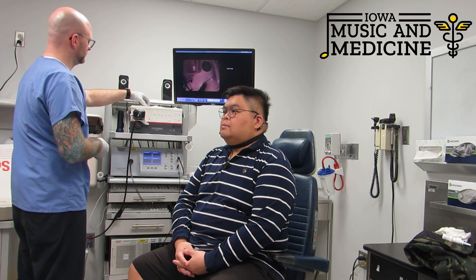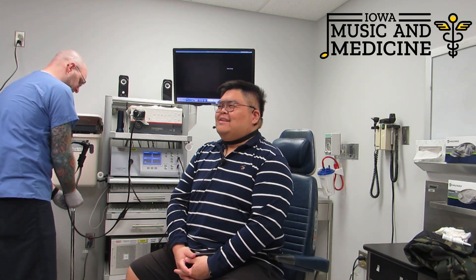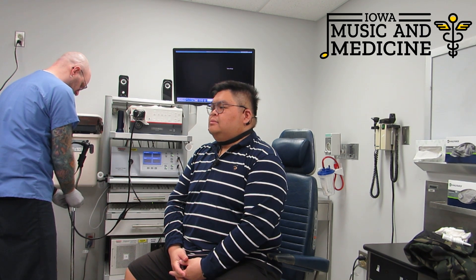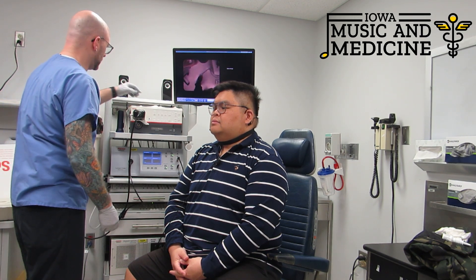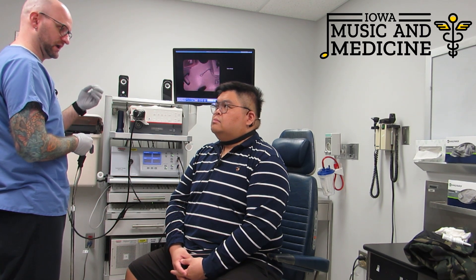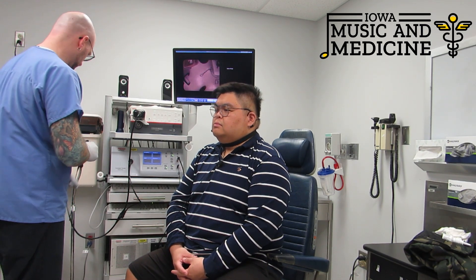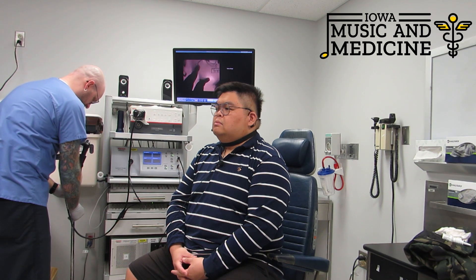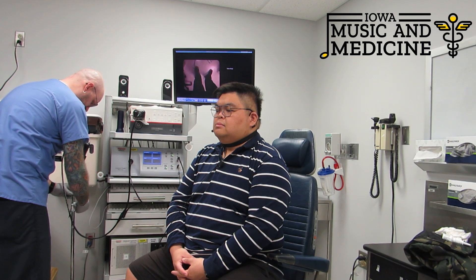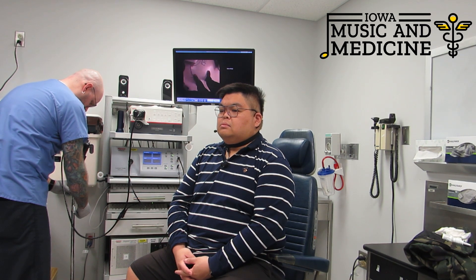What questions do you have before we take a look at things? It shouldn't hurt. You might feel a little bit of pressure as the scope is sliding through the nose, particularly towards the back where everything sort of gathers together before we make the turn. But we all have tunnels inside the nose and the scope is a lot smaller than any of the tunnels that are there. Again, with the afrin that you instilled before you came in, that's opened up those tunnels just a little bit. And you're in charge at all times — if at any point you feel like you need a little break or it's starting to be more sensitive, let me know. You can always take a pause or come out and re-administer.